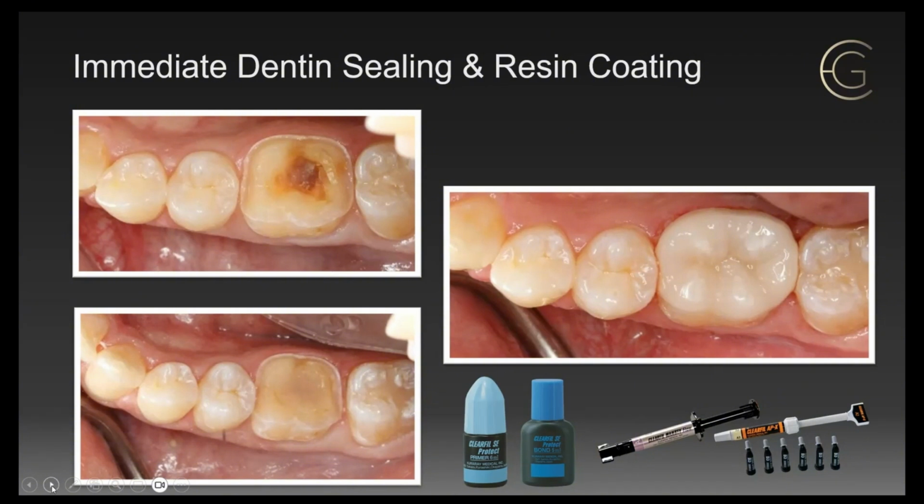This is a cool case, and it has defied everyone saying that you can't do conservative restorations with zirconia. Now get this, zirconia is the kindest material, polished, to the opposing natural tooth. Lithium disilicate is not kind to a natural opposing tooth. So keep in mind when you're ordering this from your lab, have a discussion with Mark and his crew. They're such good people, partner with them for success. I'm still a gold guy too. I'll do gold on people who brux.